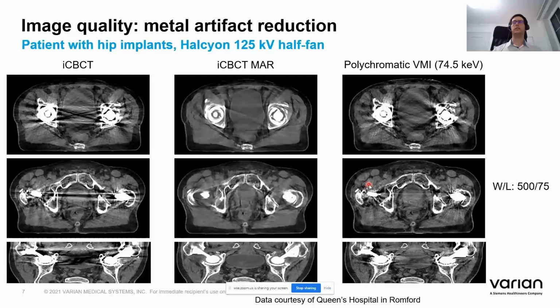Still, we do see room for improvement as there is a certain level of artifacts remaining in the reconstruction. However, from these preliminary results, we also see the benefit of applying a physics-based attenuation model in the polychromatic reconstruction to also tackle metal artifacts.